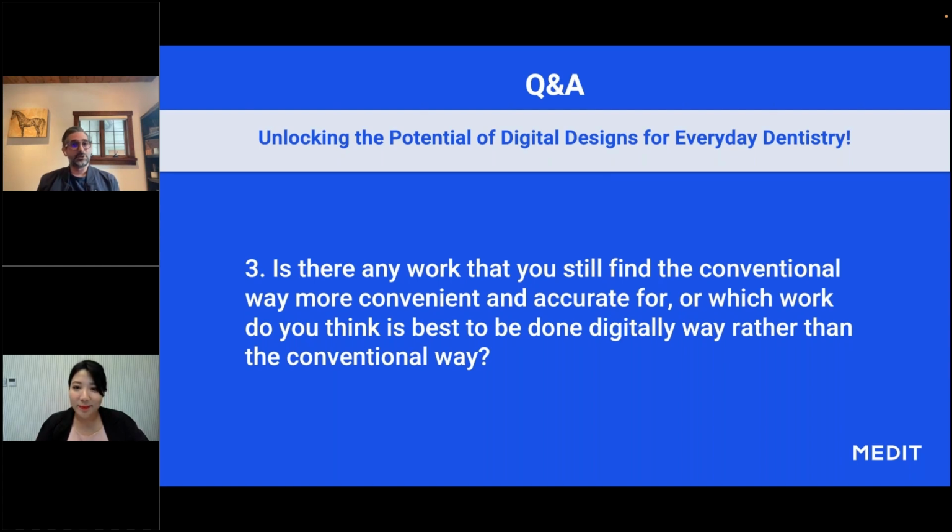I learn quickly because I'm really good with technology. So I think it depends on what type of person you are. But the advice I would give somebody who's interested in getting into it is to get it and start with what you can. Because in the early days, I didn't even try to take my final impressions with digital scan. I got it for both Invisalign and for diagnostic reasons. And that was before Medit. Then I slowly got into doing more. And once I got the Medit, I decided I'm going to try to do my impressions with this. But because I was reluctant or scared of creating problems, I did both. I would take a digital scan and a PVS impression.